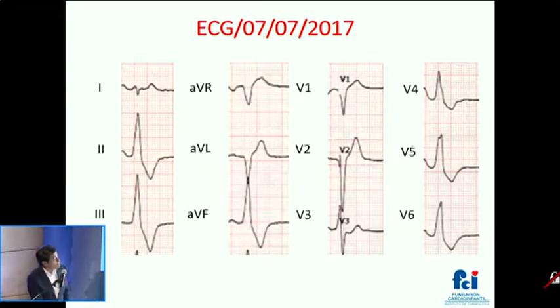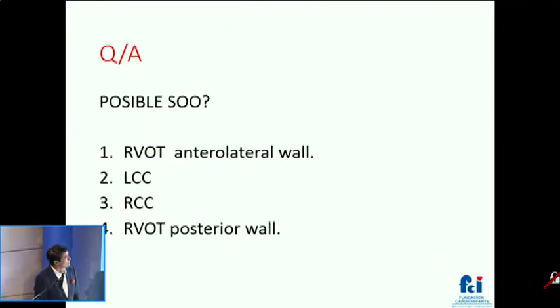Well, Dr. Sainz was saying these are the extrasystole. Remember the morphology. And after completing the analysis, let's begin to think about the localization site. Please remember to open your app, the voting zone. I think that everybody's now connected to the network. You don't need any passwords or anything. So let's cast your votes.